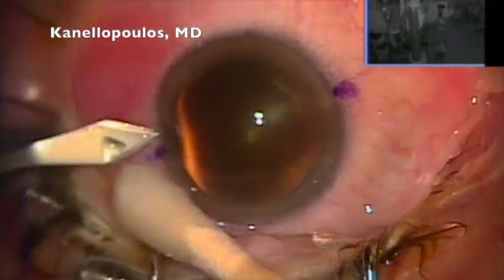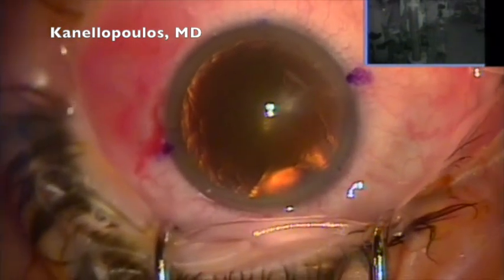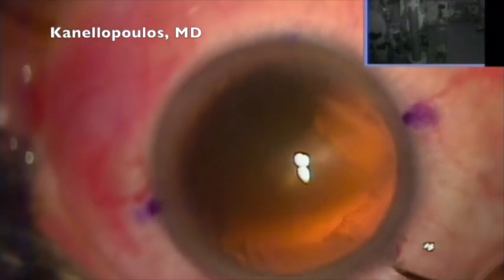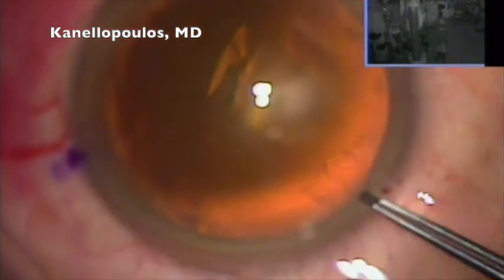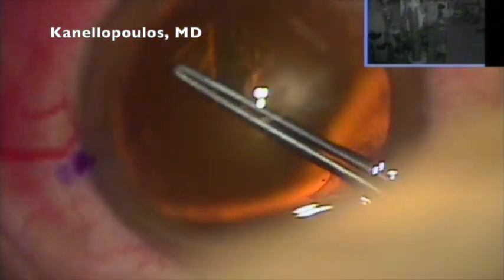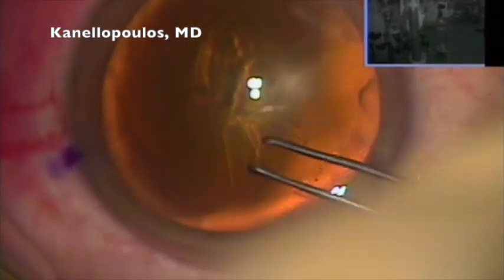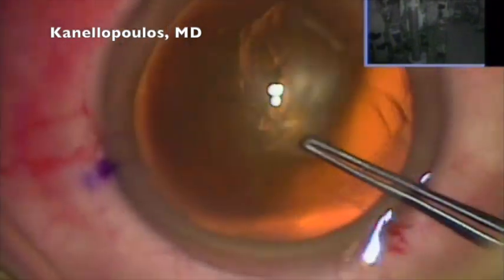My incision is always at the 135 mark. My paracentesis is just 1 millimeter. This is easier for me. This is a regular cataract procedure. I'm using methylcellulose on the surface, so we don't have to irrigate all the time, and we're doing a manual continuous curvilinear capsulorhexis, courtesy of Thomas Neuhann of Munich, Germany.